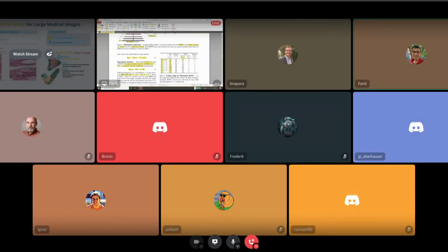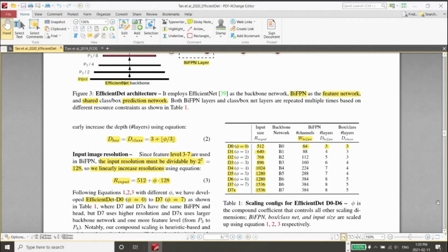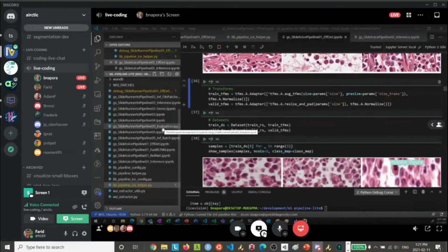I was thinking about the augmentation, that it might be helpful to use augmentation to help with the domain adaptation from different scanners. Do you think it can help to experiment with different data augmentation there? Yep, and in Christian's pipeline, the RetinaNet pipeline, they do a bit more augmentation.